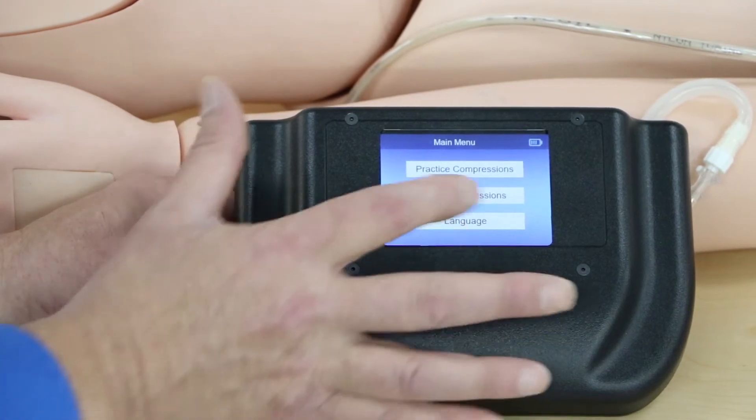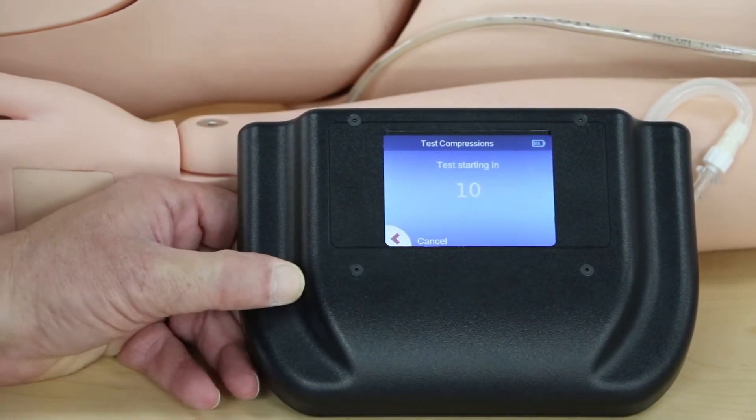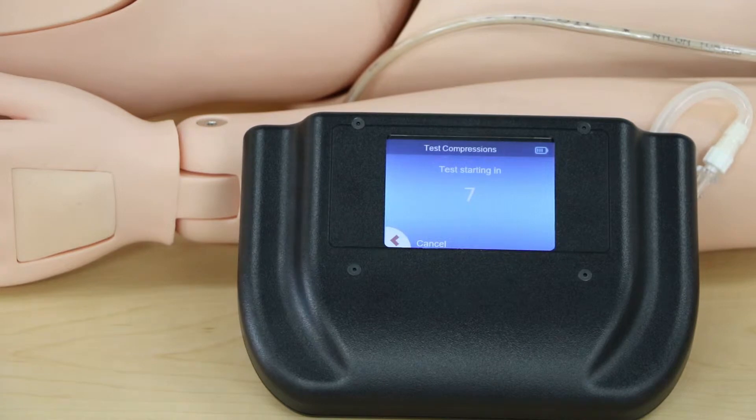Next we're going to do the test compression screen. We tap on test compressions — it gives you a 10-second countdown before it starts.